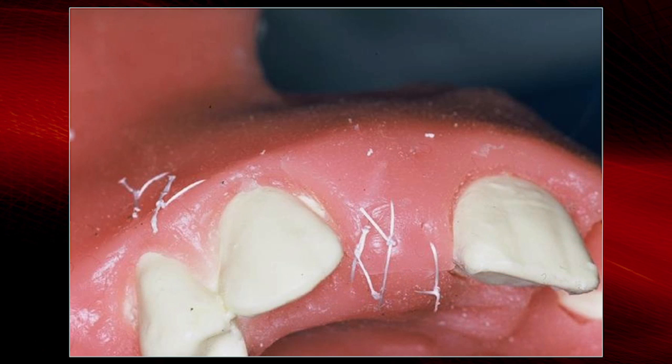So then we can make our closure, our interrupted. We want to do our obliques first and then the horizontal next. And then if we go to uncover, we can come in with this U-shaped incision here, or we can come back to this and here. It really doesn't make a lot of difference, but the main thing is you're keeping this tissue up to there.